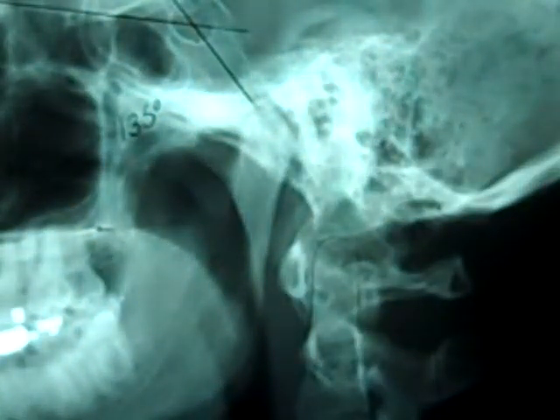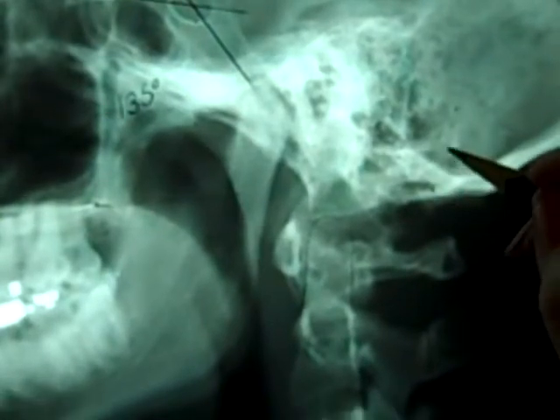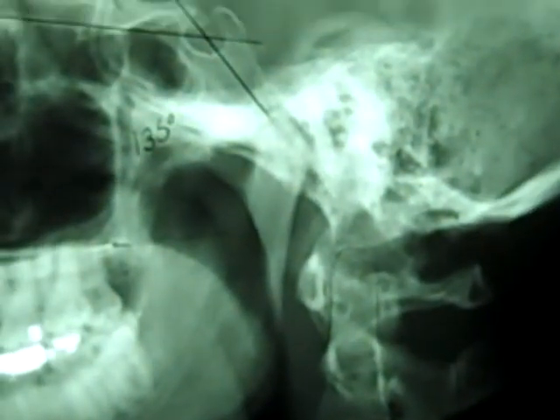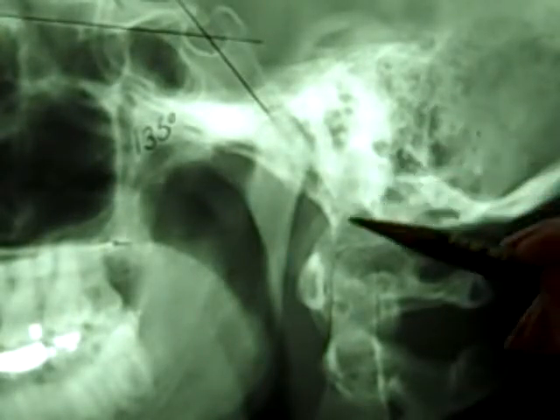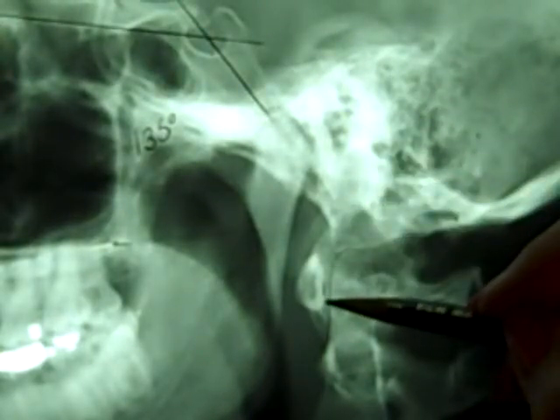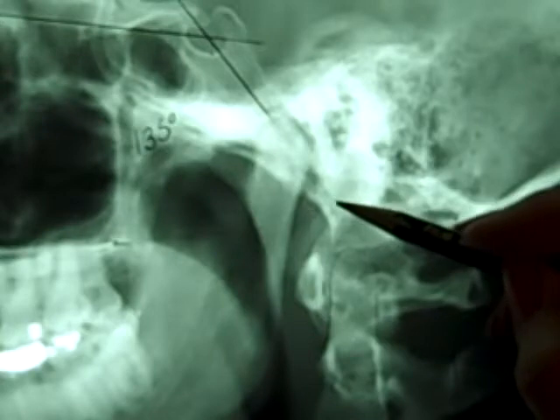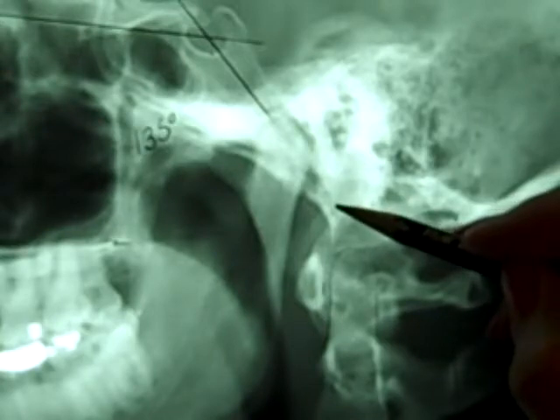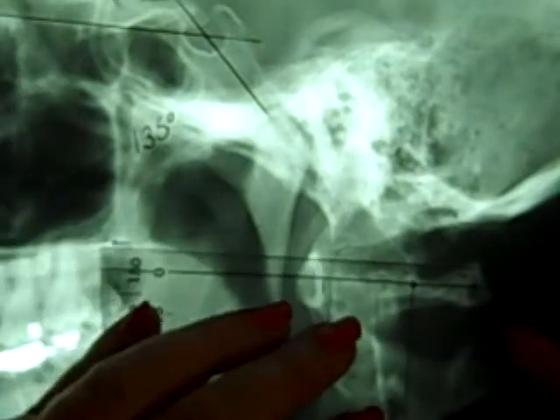All right, McRae's is going to use the posterior aspect of the foramen magnum and also the anterior portion of the foramen magnum. So again, here's the ADI. Go north. There's that sideways V right there. So the anterior part of the foramen magnum to the posterior part of the foramen magnum, and draw a line.